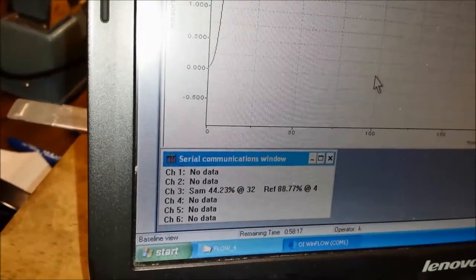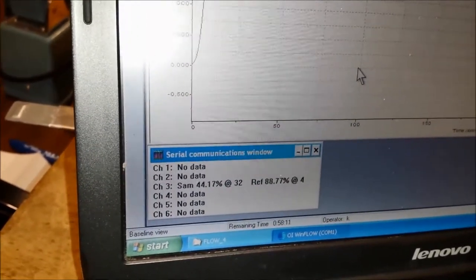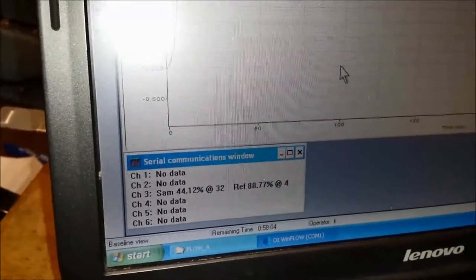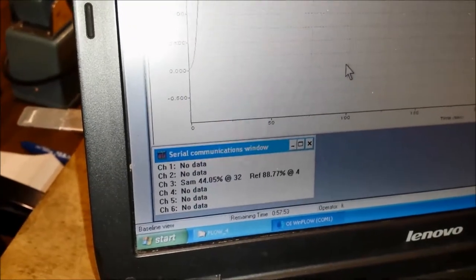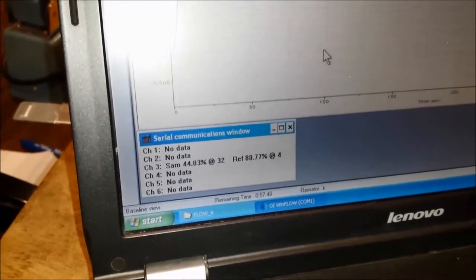So in this case, the first thing you always want to look at is the serial communication value. And right now, the serial communication value on this system, this flow cell, has a bubble in it. So the sample is at 32, which is the gain setting, and the reference is 4. Normally, this should be 4 for the reference at a 540 filter, and probably 4 or 8 for the sample. And so you know that something is blocking in the flow cell when a gain value is this high.